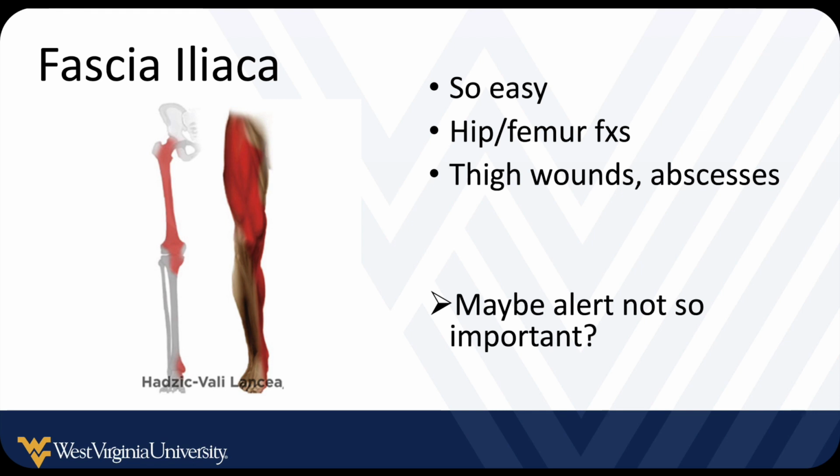This is a nice, easy block. It's great for hip and femur fractures. The most common are the hip fractures that we all see every day. But don't forget to think about it if you have a large thigh wound that you need to clean out and repair, or a large abscess somewhere on the thigh. And again, because you shouldn't have your needle right up against a nerve or an artery, some of these older patients who have hip fractures, sometimes maybe they have some dementia or something else, and in these patients, that's okay, because again, the risk is lower.